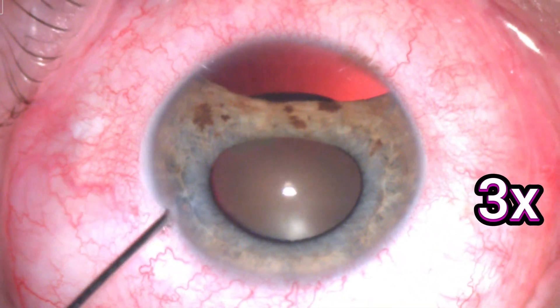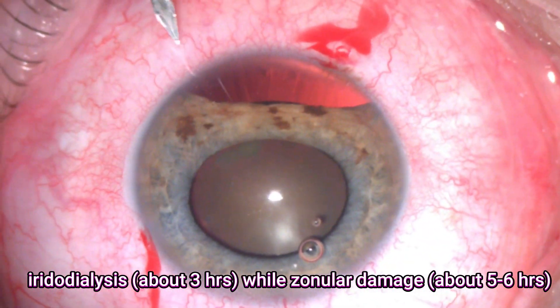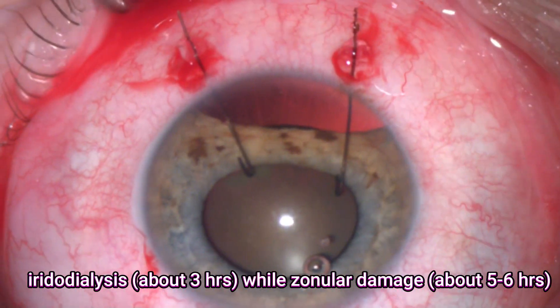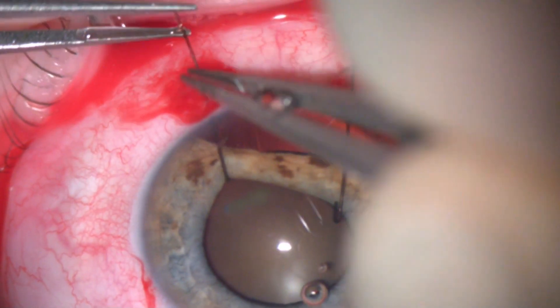It's important to note that the extent of zonular damage is much larger than the area of the iridodialysis. I expect there is about three hours of iridodialysis, but the area of zonular damage would be at least five to six hours.